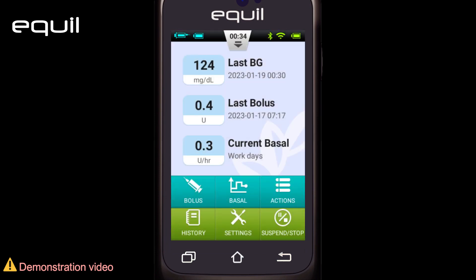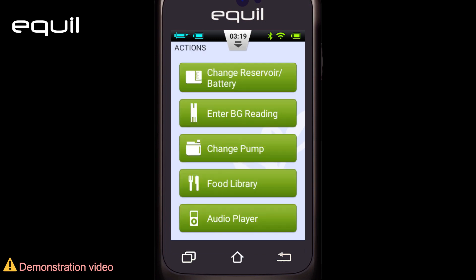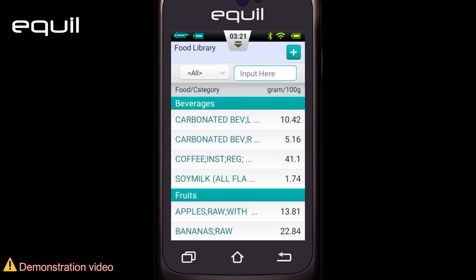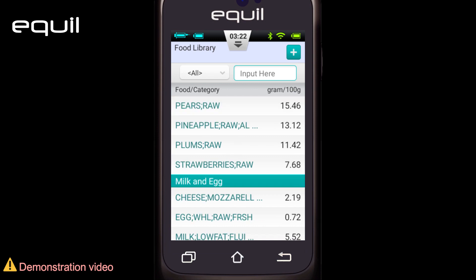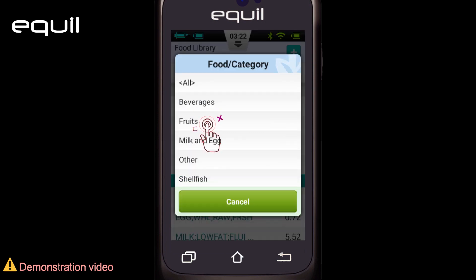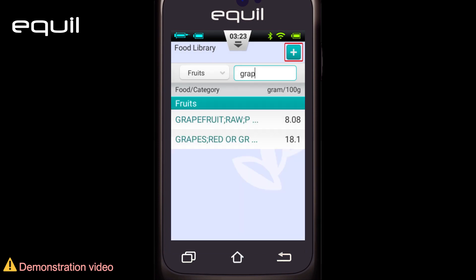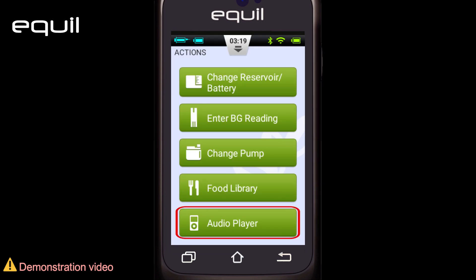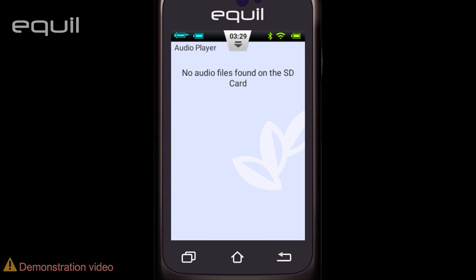Third, the Actions button, which brings up the actions screen where we can perform several operations: changing the pump battery or starting a new reservoir, initiating a new pump — all explained in the pump installation video. We can also manually enter the blood sugar measurement value and determine the user's condition at the time of the test. The food library contains a list of carbohydrates found in a wide variety of known foods, allowing us to search by name and category. By clicking on the plus sign, we are able to add our own favorite food and its attributes to the list. The last item in actions is the audio player, which is only available if the PDA is equipped with a memory card.